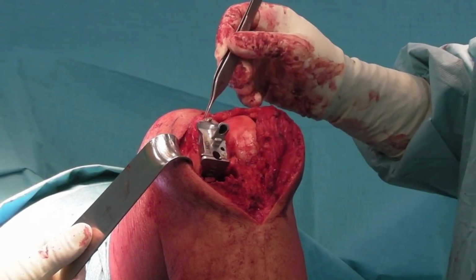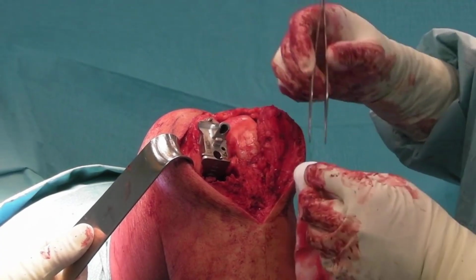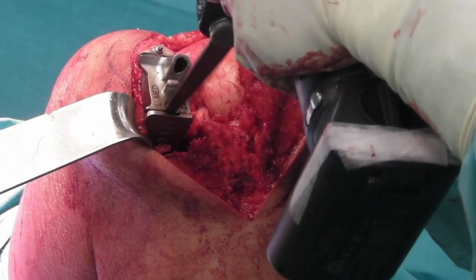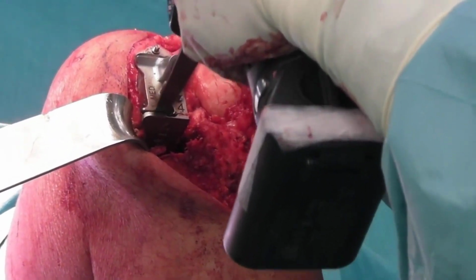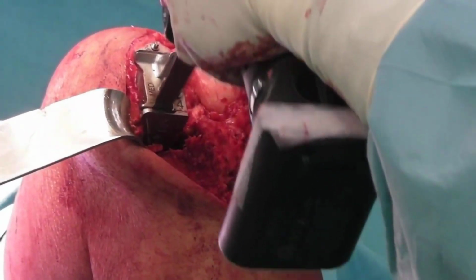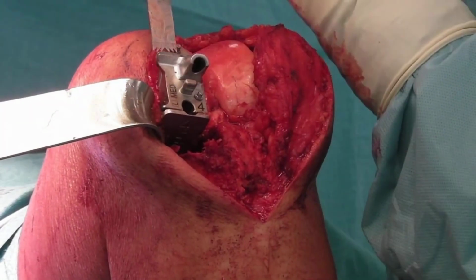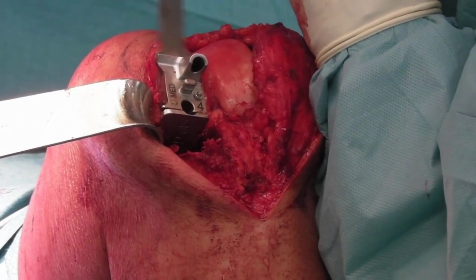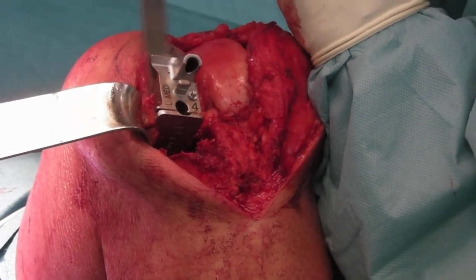Once the vertical and horizontal cuts have been completed, the inner part of the tibia is easily removed, and we can then move on to perform the same type of procedure, but using different cutting guides at the level of the femur. The great advantage of all these cutting guides is that they provide a space within which the saw blade follows a preset path, allowing extremely precise cuts to be made.